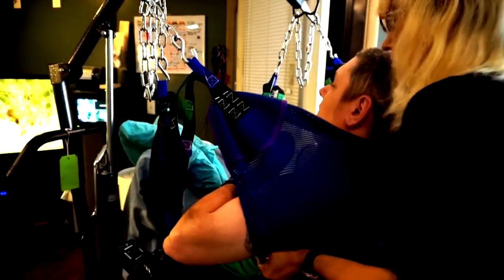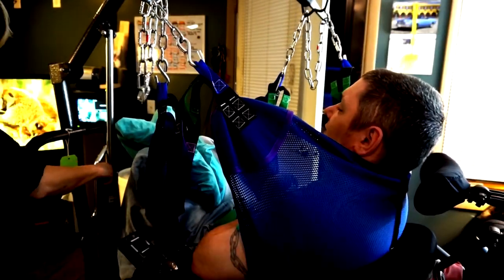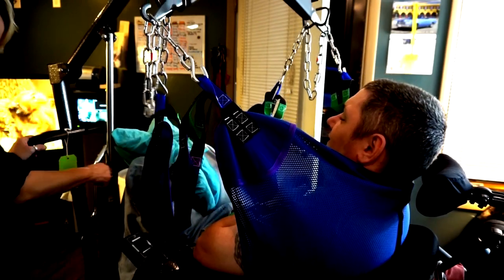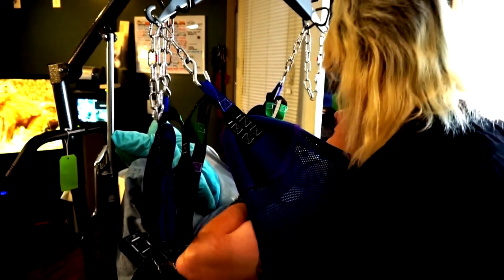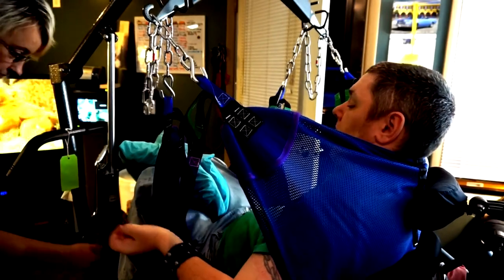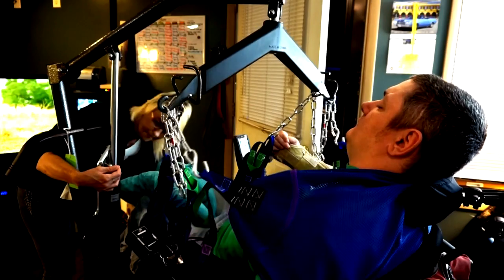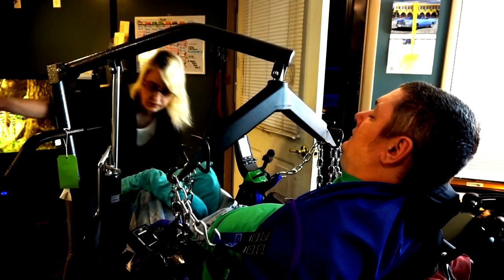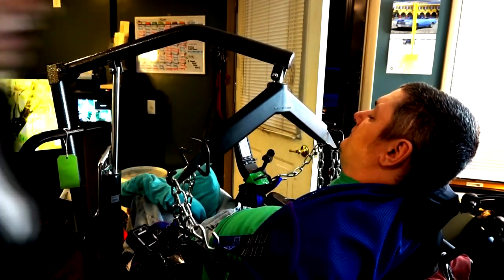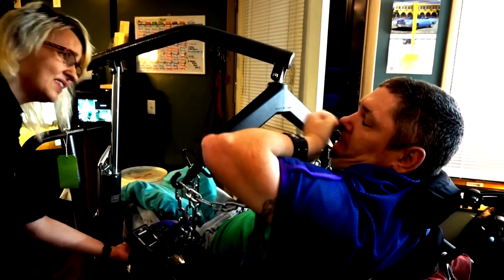I drop the sling down just a little bit and give a couple tugs. I kind of alternate tilting the chair back and tugging so my butt goes as far back as I can get it. I give another little tug, then lower down enough so I can get the chains off, and I unhook the chains.